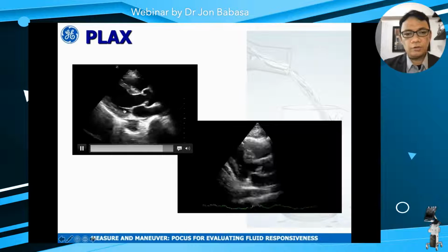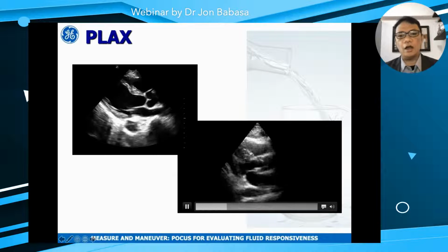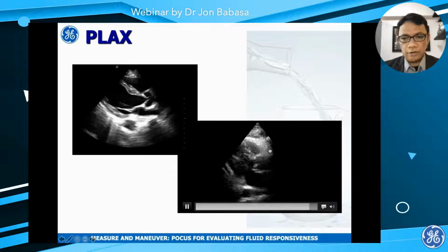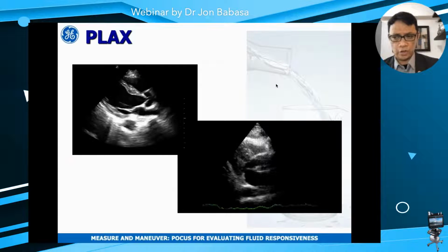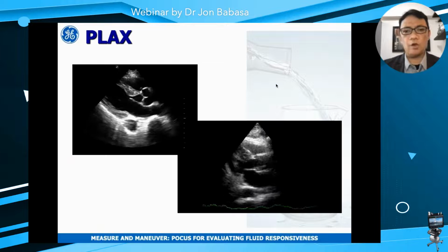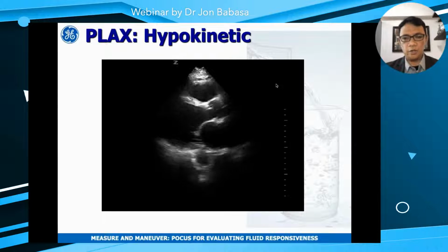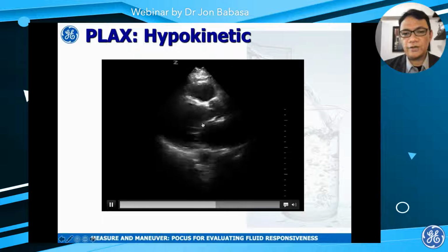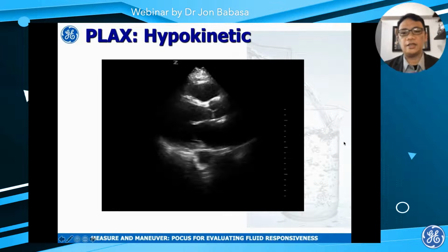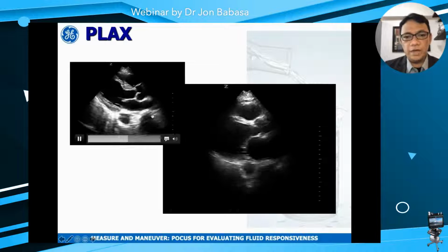This one is thickening to about 2 times its baseline thickness, but from here you can see that the contraction reaches up to the other side of the chamber. And also the rate is quite faster than this one. So you have tachycardia and really dynamic, hyperkinetic squeezing of the chamber walls. Now, compared to hypokinetic, which connotes a patient who is probably fluid intolerant or doesn't need any more fluids or will go into fluid overload if you give fluids, you can see right there, there's minimal swinging of the mitral valve and the cardiac muscle is not actually thickening. And then compared side by side with the normal kinetic heart, you can see the big difference between the two.